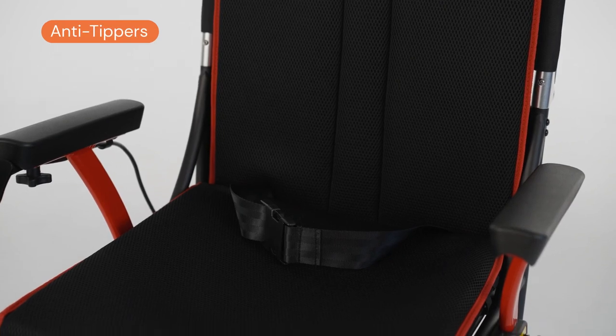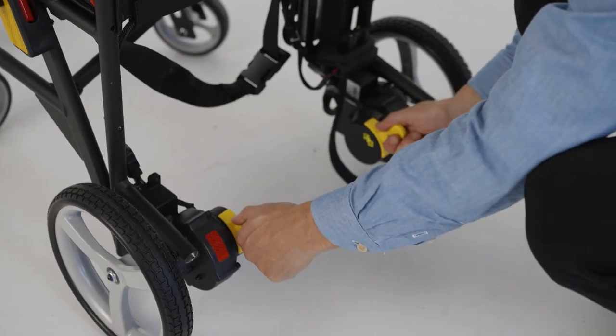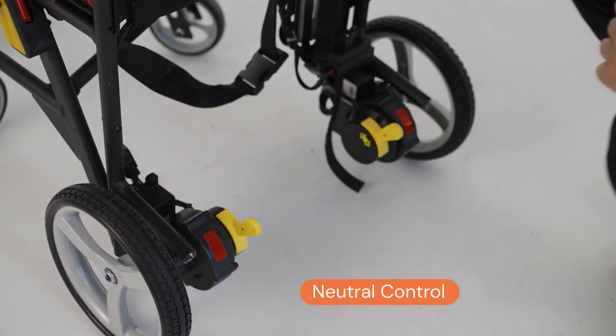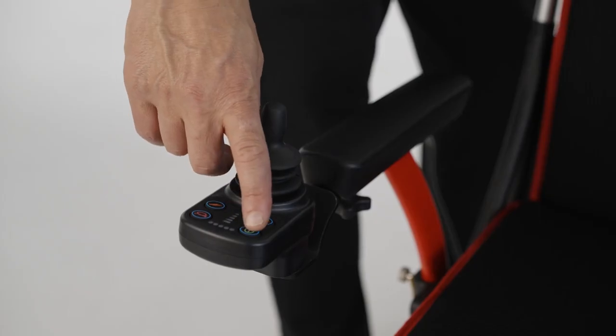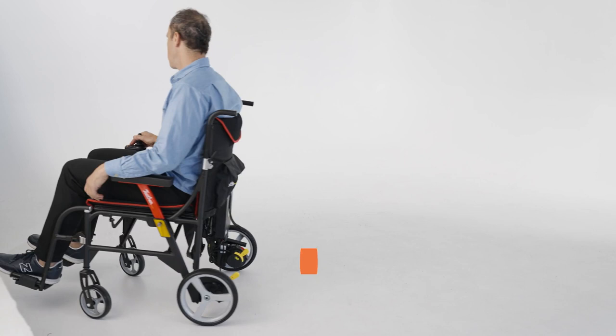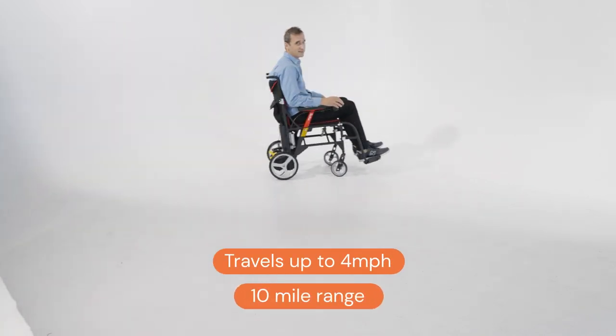Safety: it has anti-tippers and it has a safety belt. You could also put the wheelchair into neutral if you ran out of electricity or you want to be pushed by a caregiver. The joystick is super easy to use. It goes as fast as four miles an hour with a 10-mile full day range.